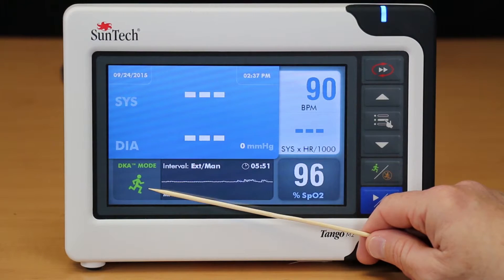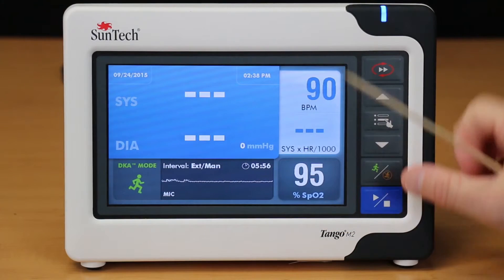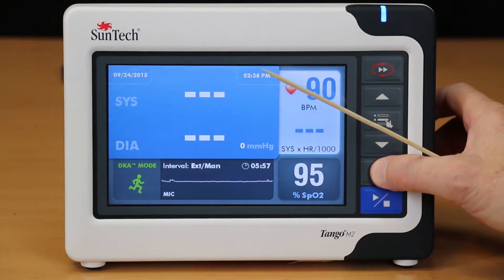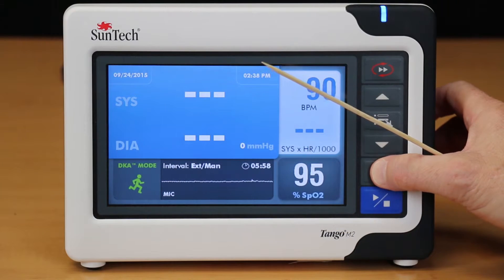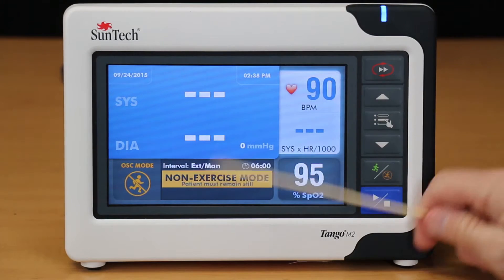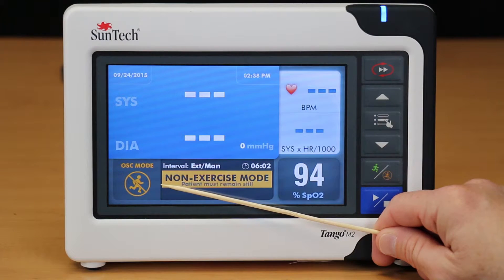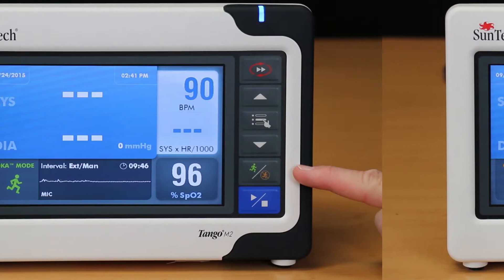On the left side of the K sound window is the mode indicator. This enables you to easily see if the monitor is set to the DKA mode, which will be indicated with a green running man icon, or the OSC mode, which will be indicated by an orange non-running man icon.